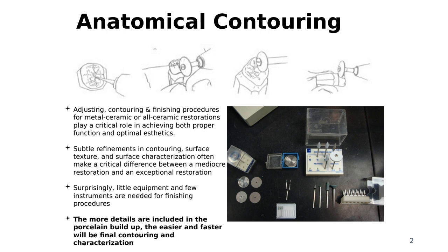Diamonds? We can use a diamond. Okay, can we use stones or ceramics? No, stones will contaminate it. We can use stones, right? Yeah, we can use stones. For e.max, for instance, you guys didn't use any stones in your lab to grind?